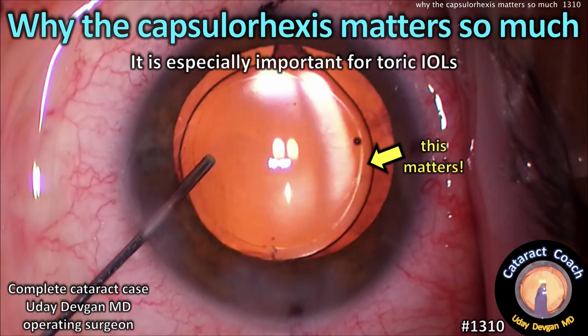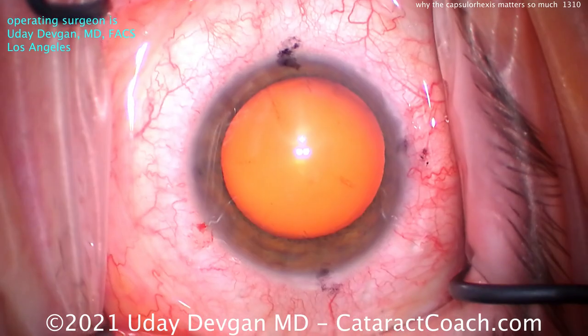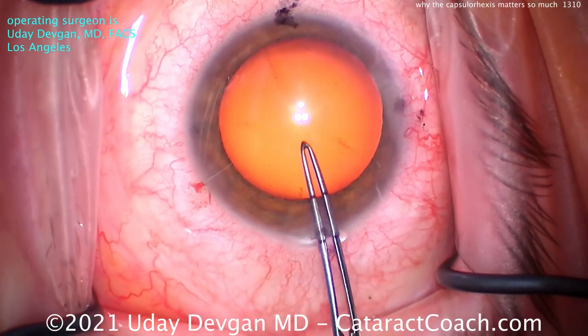CataractCoach.com. Why the capsulorhexis matters so much — and it's especially important for toric lenses. So let's look at this toric lens case.